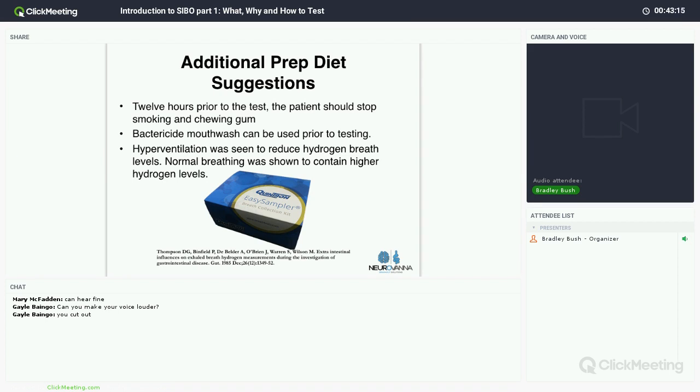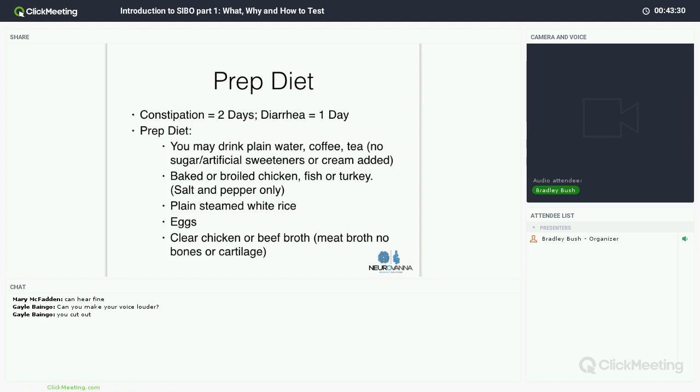So it's important when you tell the patient about the collection, it's not how hard you breathe. It's just a normal breath you breathe out during the collection. And the vacuum tubes that are included in the collection materials will just capture that sample, no problem.